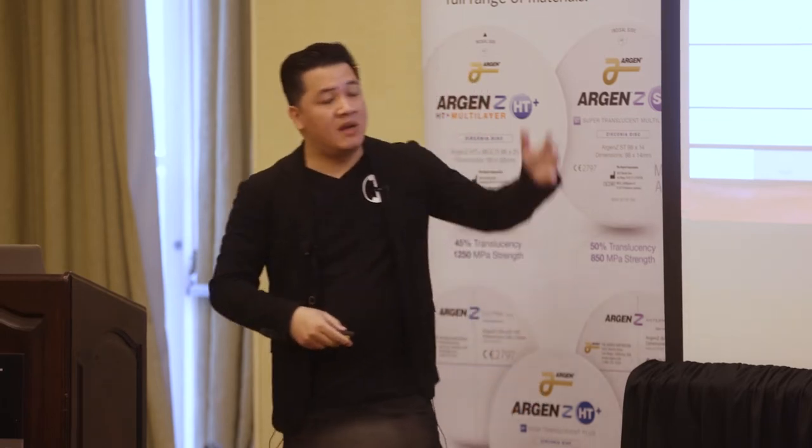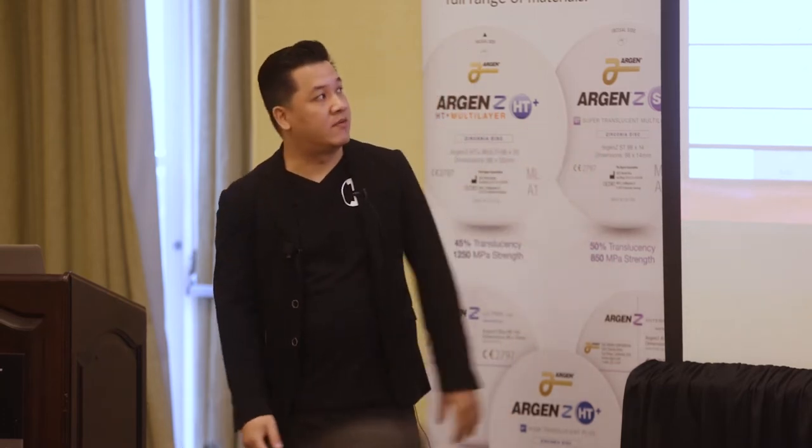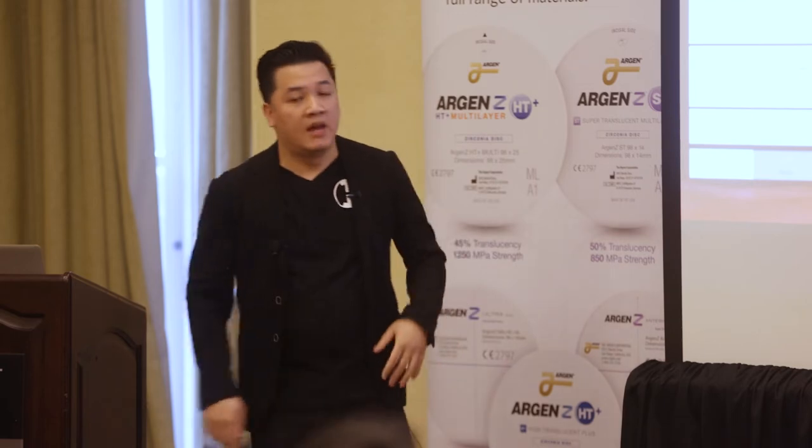With a smile design, something as simple as this, you snap two pictures, and then you present it to the patient. I can make 5, 6, 7 different designs. I can make rounded shapes, triangular shapes, toilet bowl white, chocolate brown, whatever shade they want, whatever shape they want. And you present to the patient.